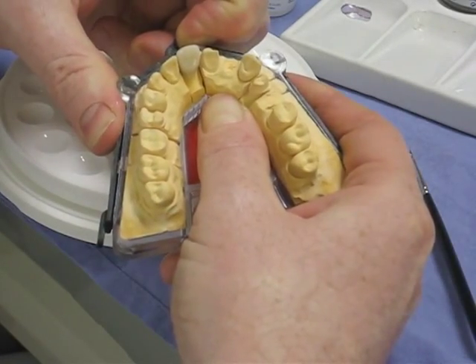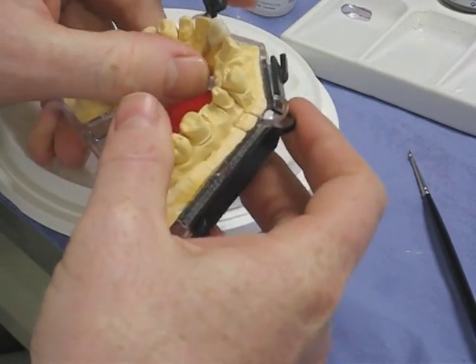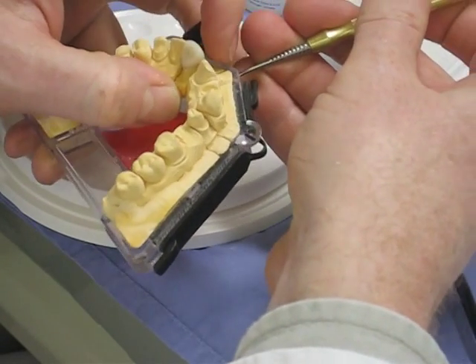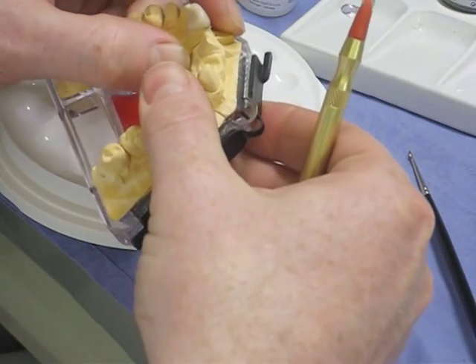Then, taking the die with the crown out of the model, I'll put some stain on interproximately as well, just to darken it down there in the margin region.